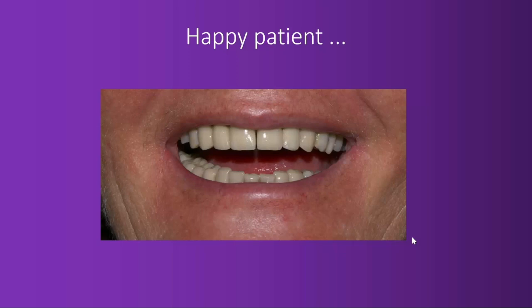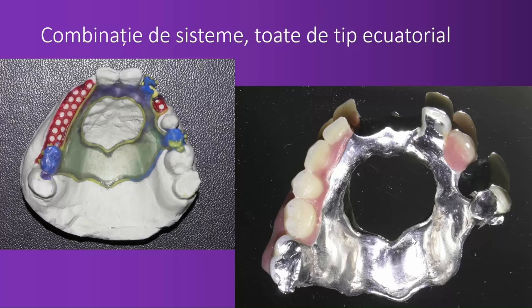When you place implants, it is like close air support, right? Like the fighter jets come into the battle. Okay, now another system, equatorial system. You see, the bar also is equatorial, right? The bar is drop shaped. And the rider does a click when it sits on the bar, right? So it's an equatorial system, a click type system.